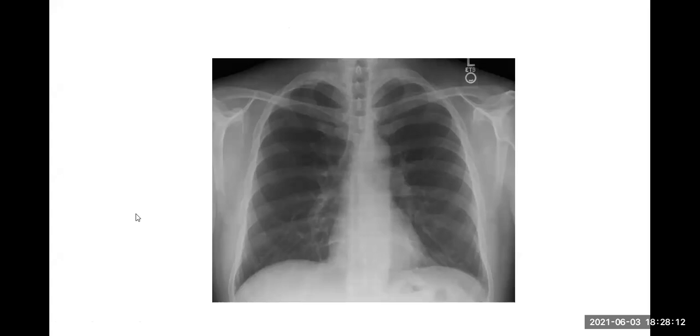Now this is a normal chest X-ray. There are a few important principles when you look at chest X-rays. Again, like in an ECG, there is an order in which you comment on it. The first thing to do is look at the airways, airways leading into the lung fields. We trace along the airway leading into the lung fields. Then look at the blood vessels. Look here near the hilum, you see blood vessels. So airways and lung shadows, blood vessels, and then the cardiac shadow.